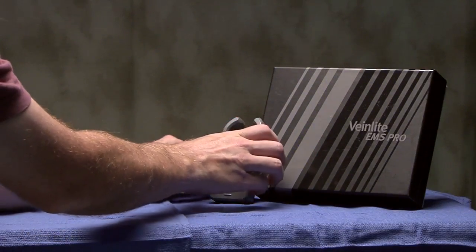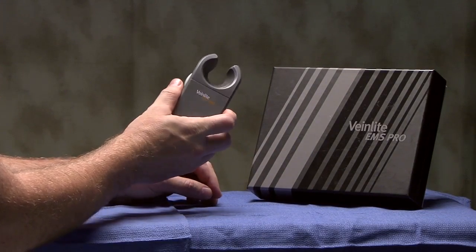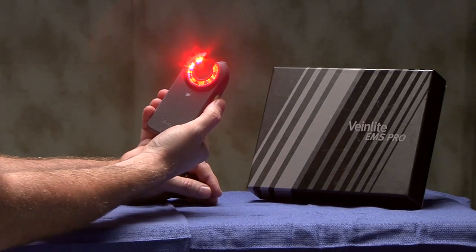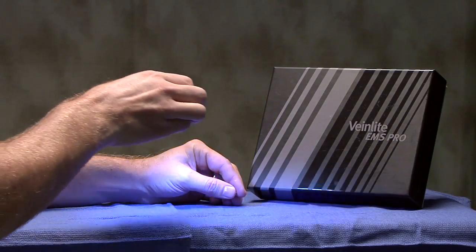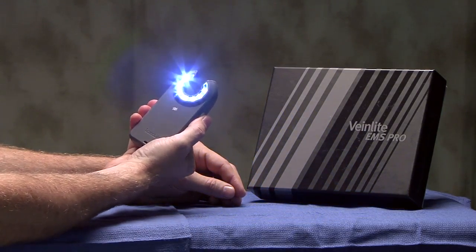The VeinLight EMS Pro adds a unique feature to our single-button line of products. As with other devices, pressing the button a single time will activate the red and orange LEDs. However, pressing the button a second time will activate a white exam light for surface illumination and use in initial patient assessment. Pressing the button a third time will turn off the LEDs.